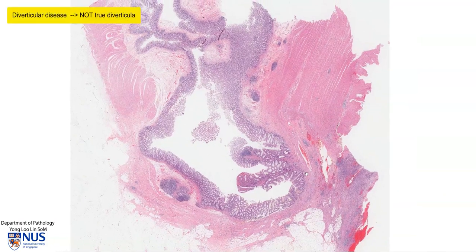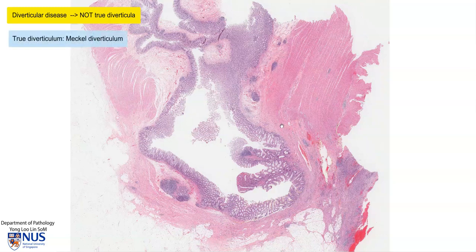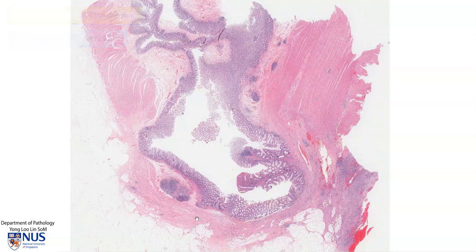So, in summary, this is an example of a colonic diverticulum. This is not a true diverticulum — for example, a Meckel diverticulum or a congenital diverticulum where you see the full layers of the bowel wall surrounding the diverticulum. But instead, this penetrates through the wall of the bowel and only takes along with it a little bit of the muscularis mucosae. Thank you.